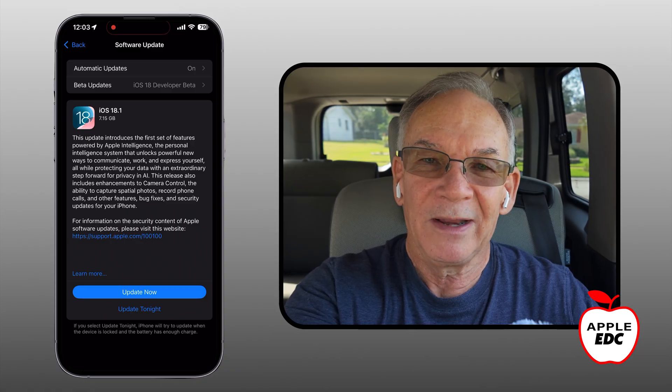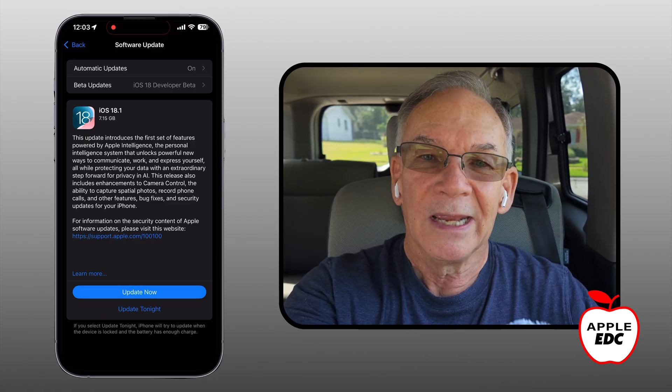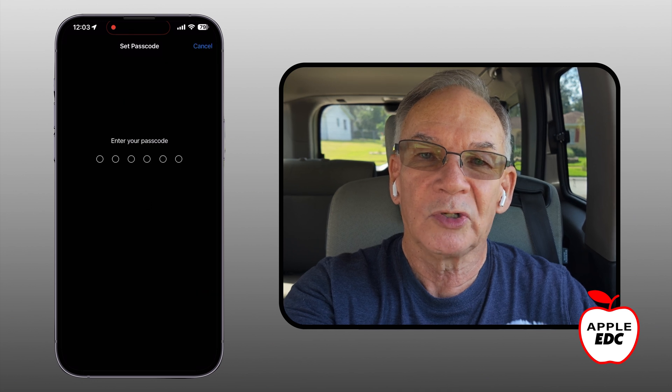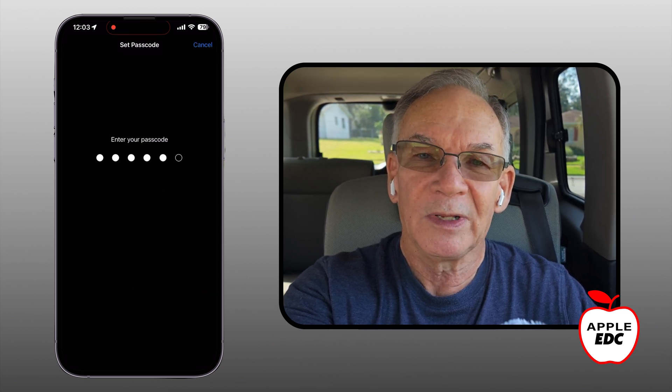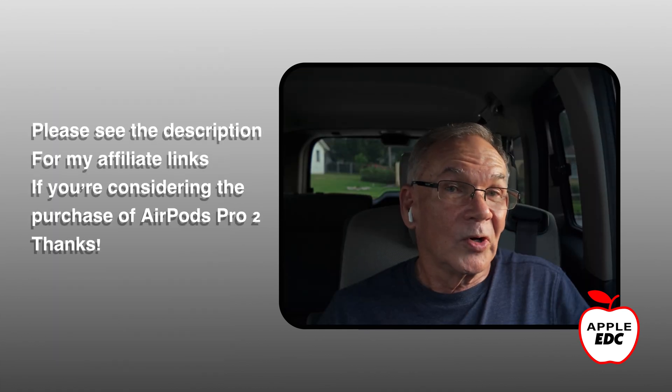I really enjoyed the hearing aid feature, so here's how I set it up. I downloaded a beta version of iOS 18.1 — it's the release candidate version, so it should be very similar, if not identical, to the general release coming this week. For the hearing aid feature to work, you need to have AirPods Pro 2 earphones.